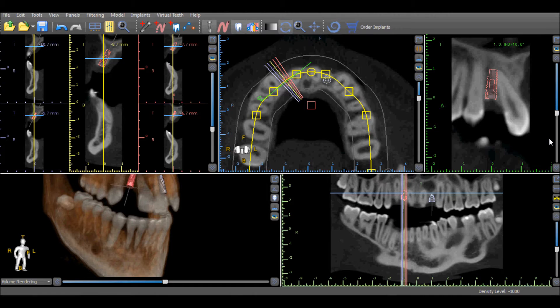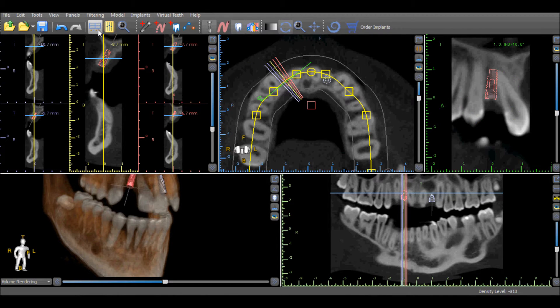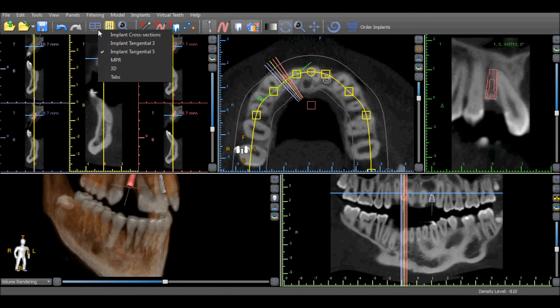If the tangential view is not visible on your screen currently, go to the layout drop-down options and select either implant tangential 3 or implant tangential 5.